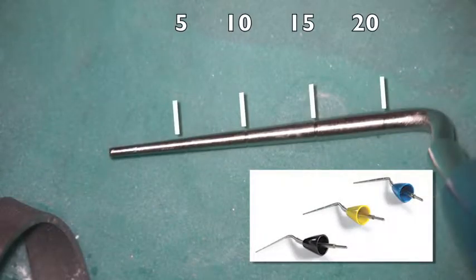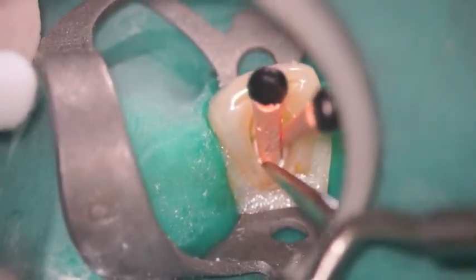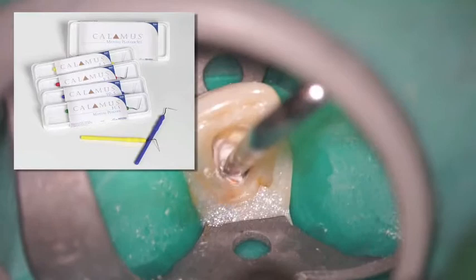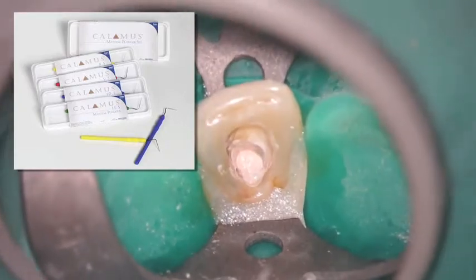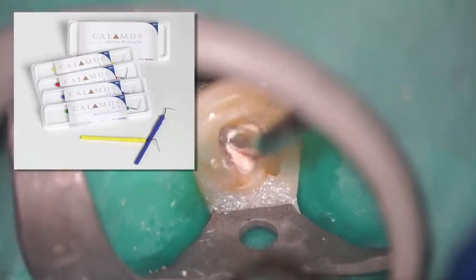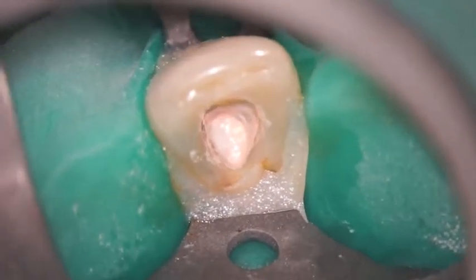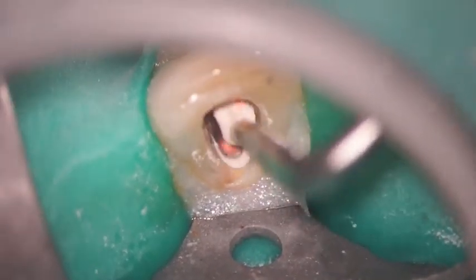Here's the calamus heat tip and the plugger tip. I'm going to sear that right off at orifice level. Then I'm going to take a larger size calamus plugger and immediately capture that gutta percha and condense it vertically. Obviously there's a little bit of sealer with it. I might go to a smaller plugger tip or a larger one. With the vivid illustration and being able to see it so well through a microscope, it gives you a tremendous amount of confidence in making certain that you're capturing all of the rubber in that access cavity and condensing it vertically.